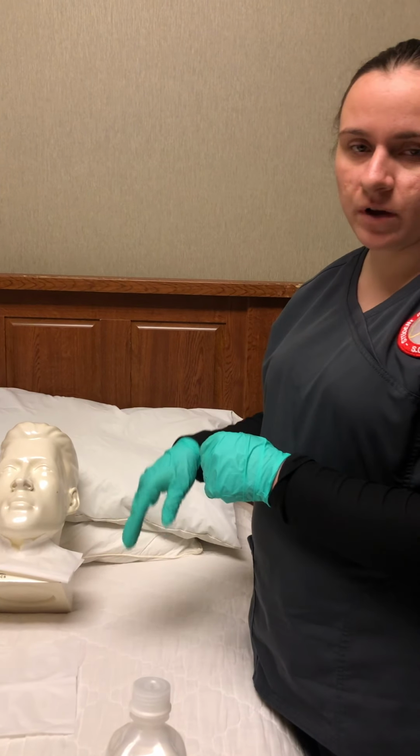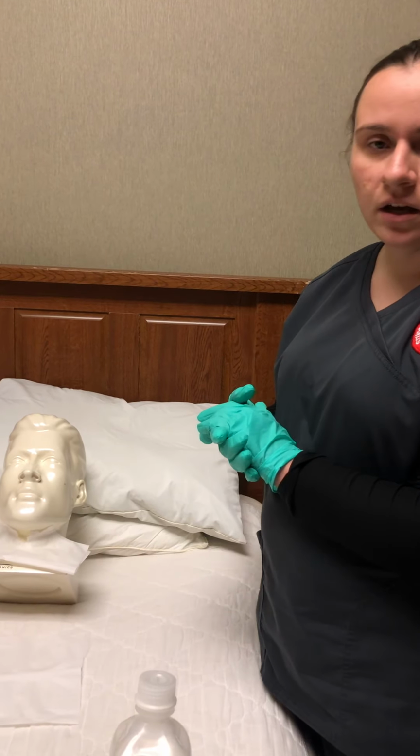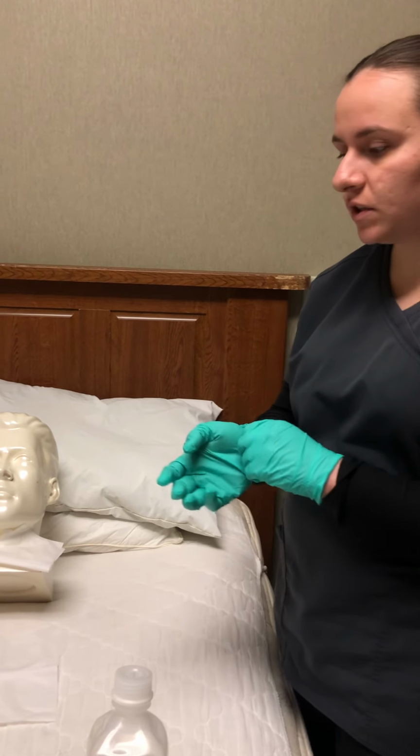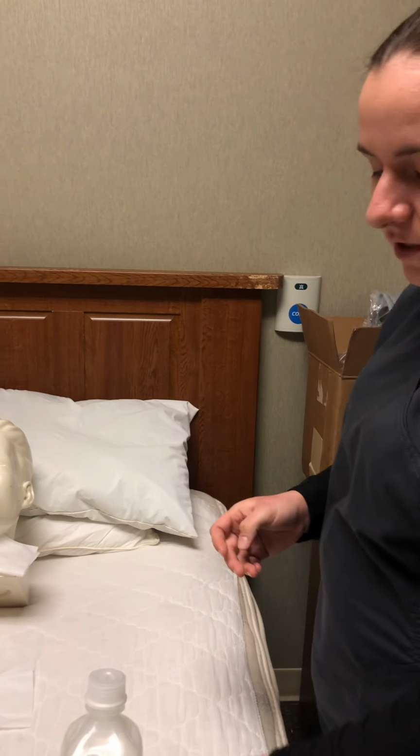We also need to listen around it. We need to listen to the breath sounds, make sure everything sounds okay, and check the vital signs. You would always remove your PPE when you are done checking the patient and everything looks good. You would always wash your hands, and when you leave the room, you always want to chart on the patient's chart the date and time that you did the procedure, what kind of procedure you did, and let the nurses and doctors know that you did a tracheostomy care.